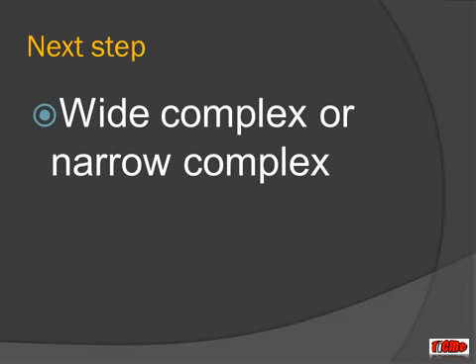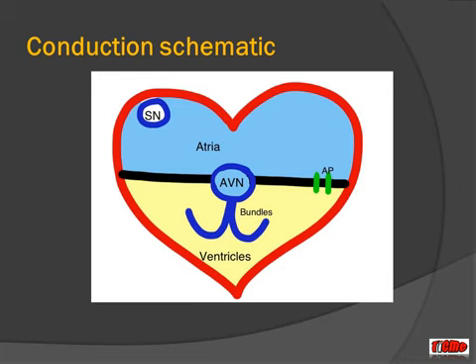Next step is to decide whether it's wide complex or narrow complex, and we're going to talk all about wide complex tachycardias today. Okay, before we get into the detail of wide complex tachycardias, I just want to talk about how we work out the difference between wide and narrows, and to understand the conduction we need a simple smiley dog face picture of the conduction system of the heart.